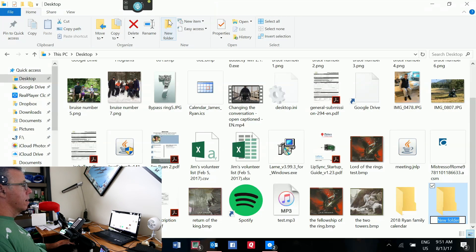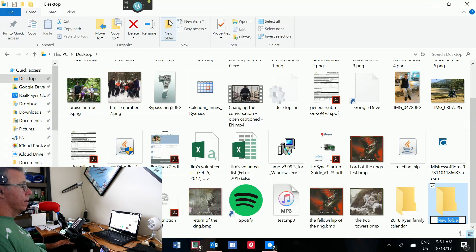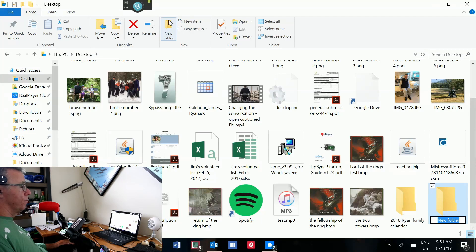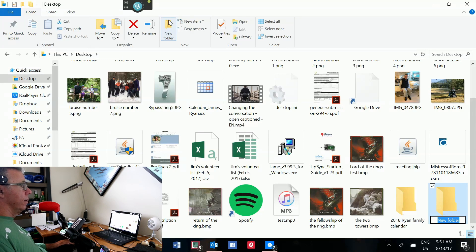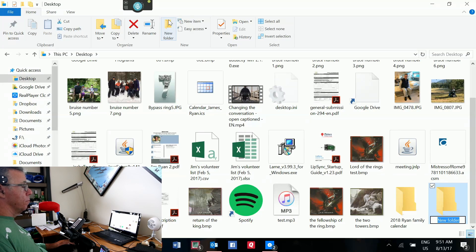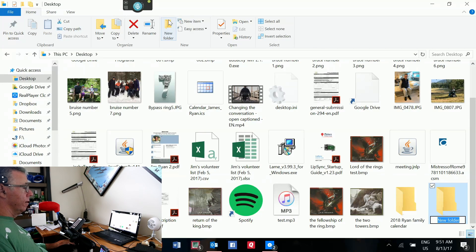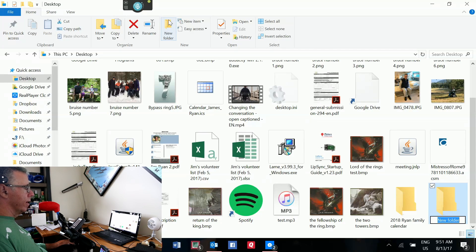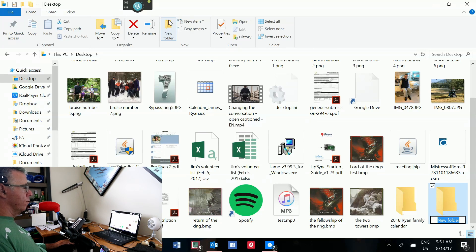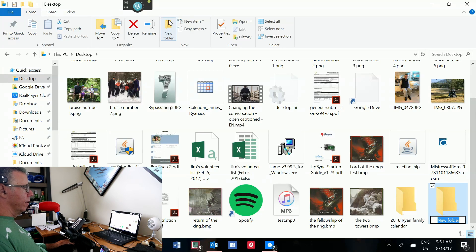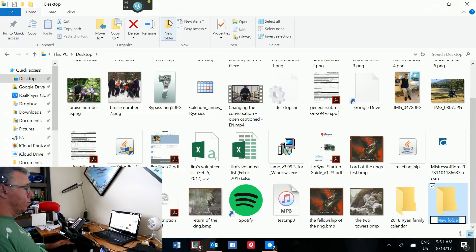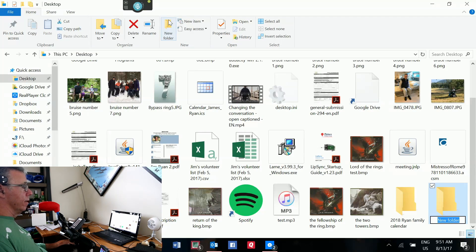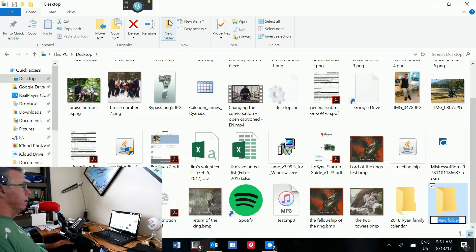So, you just created a new folder with your sip and puff. And then you turned on the microphone or your Dragon Naturally Speaking to spell out what you wanted. And then you said left click, but it didn't spell left click. No, I said mouse click. Mouse click, that's right. So, then the Dragon software, with Dragon Naturally Speaking as a software, knows I want to click the mouse. So, I say mouse click, mouse left click, mouse double click. And that will bring on the next thing. So, it does some of the things your Lip Sync does. Exactly.